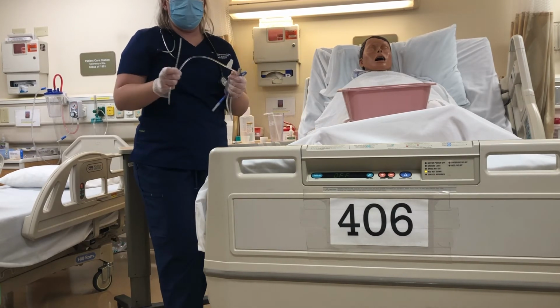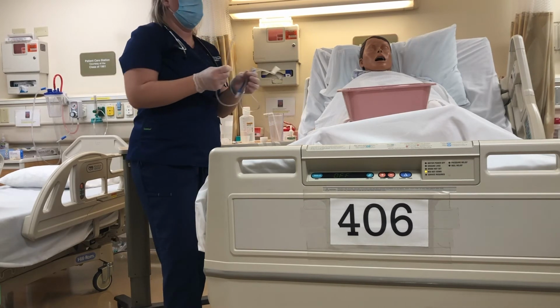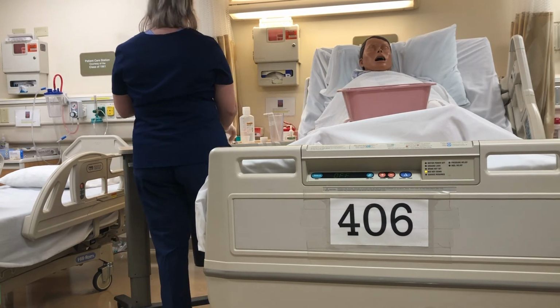So I am going to check for patency of the NG tube before I place it. So I'm just going to pass some sterile water through the NG just to ensure that there aren't any obstructions within the tube itself.